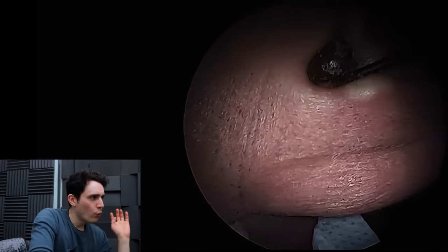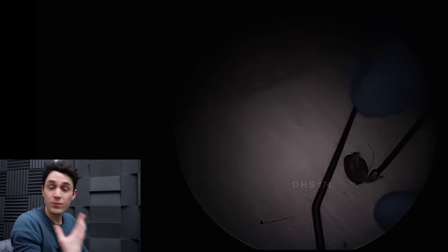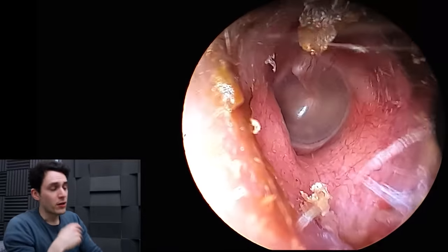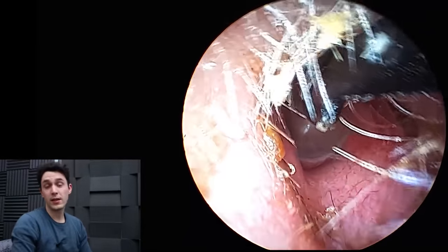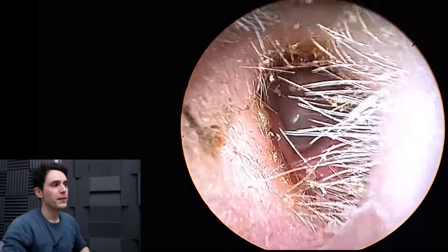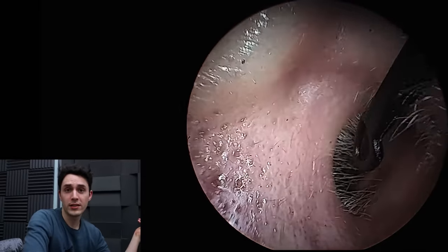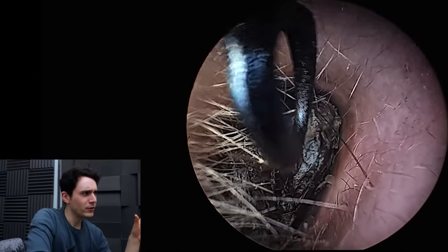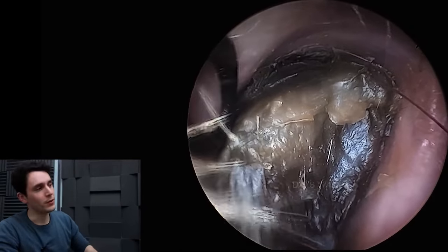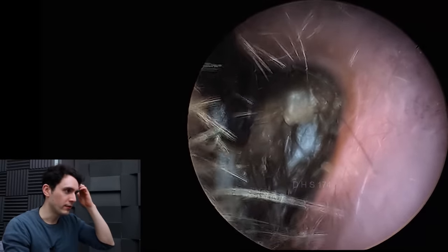So what has Neil done? He's made the rye curette, which has been inspired by a Jobson horn, and he's made a rye pick, which I think is probably his version of a Rosen inserter. This is the difficult ear — the outer layer is hard as nails, but thankfully the inner layers are a bit more acquiescent to scooping and hooking.